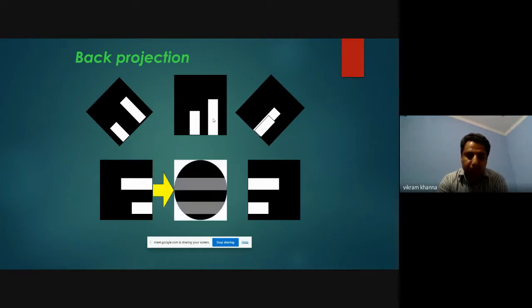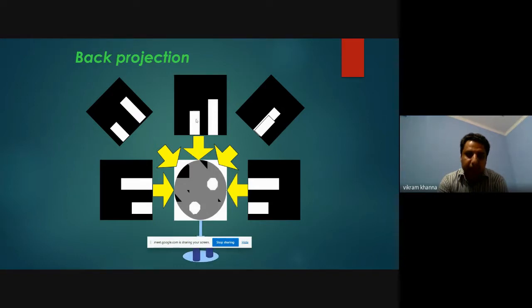The second picture shows how it has been rebuilt on the computer from the data of the first, second, third, fourth and fifth. This process is called back projection, because the original data is back projected in the computer, and then you can get a real image.